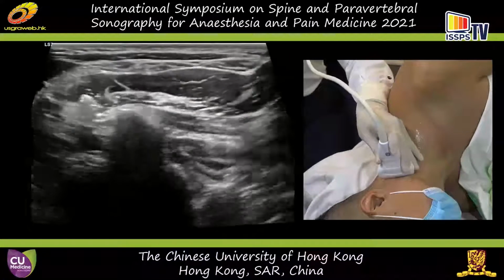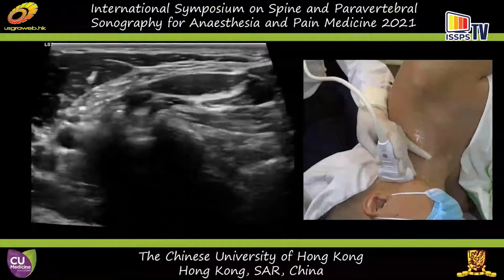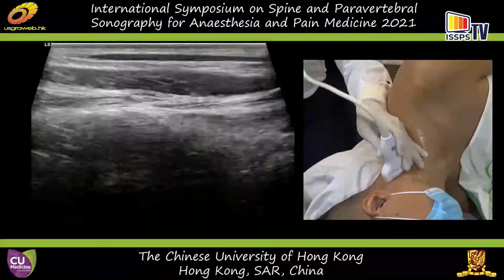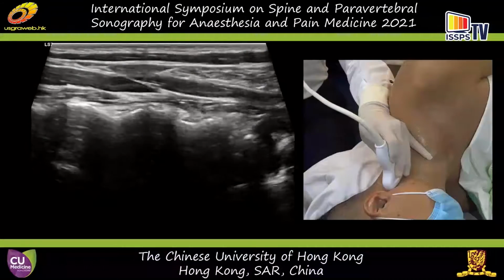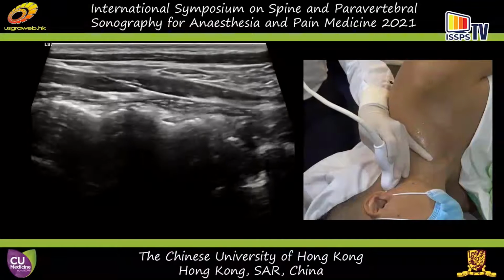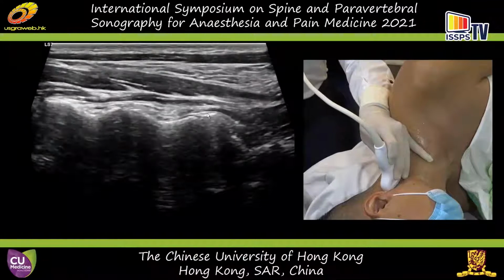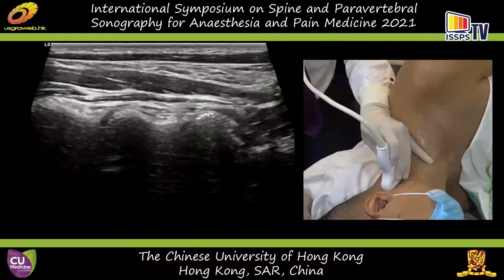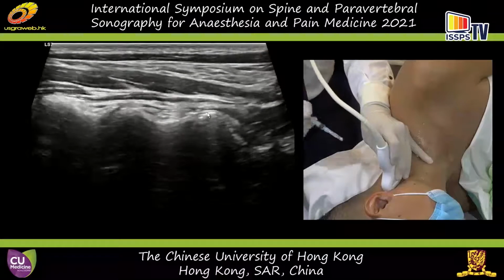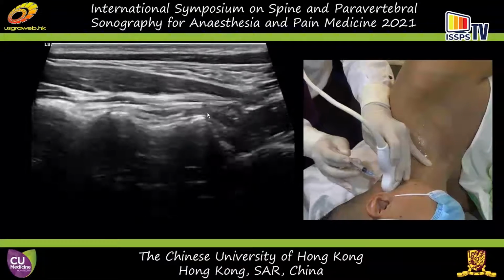So let's go back to our lateral view of the lateral side of the neck. If we want to do an intervention to the joint or to the medial branch here, for example, when we want to do a C3, which is the third occipital nerve right here, we can do a posterior to anterior approach with the needle coming from here.